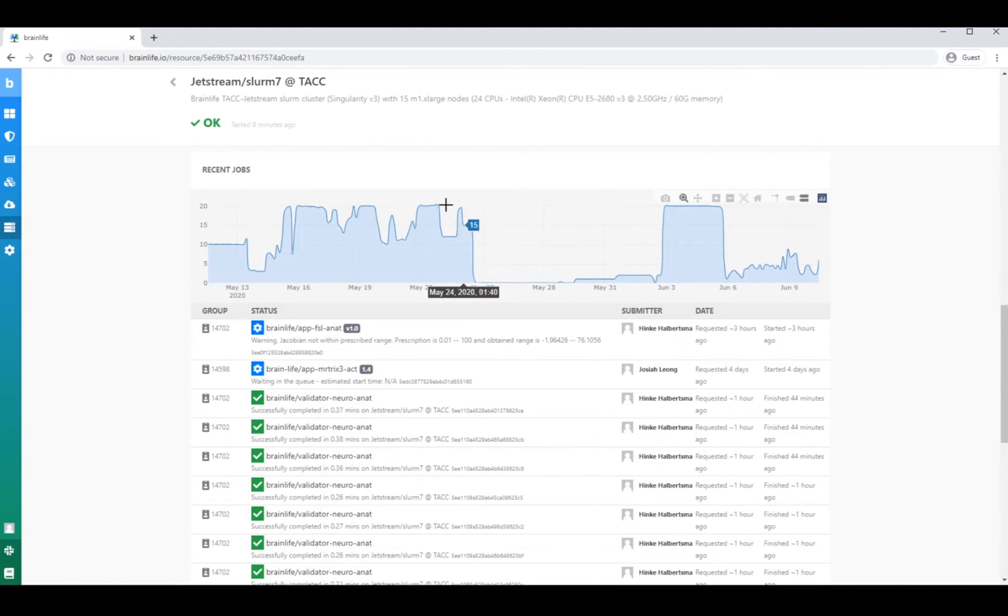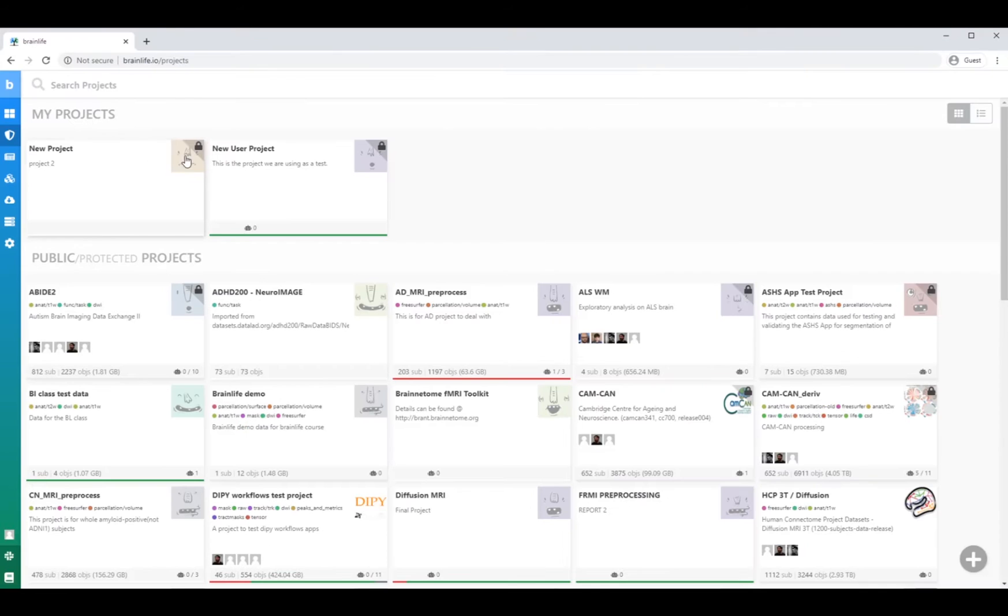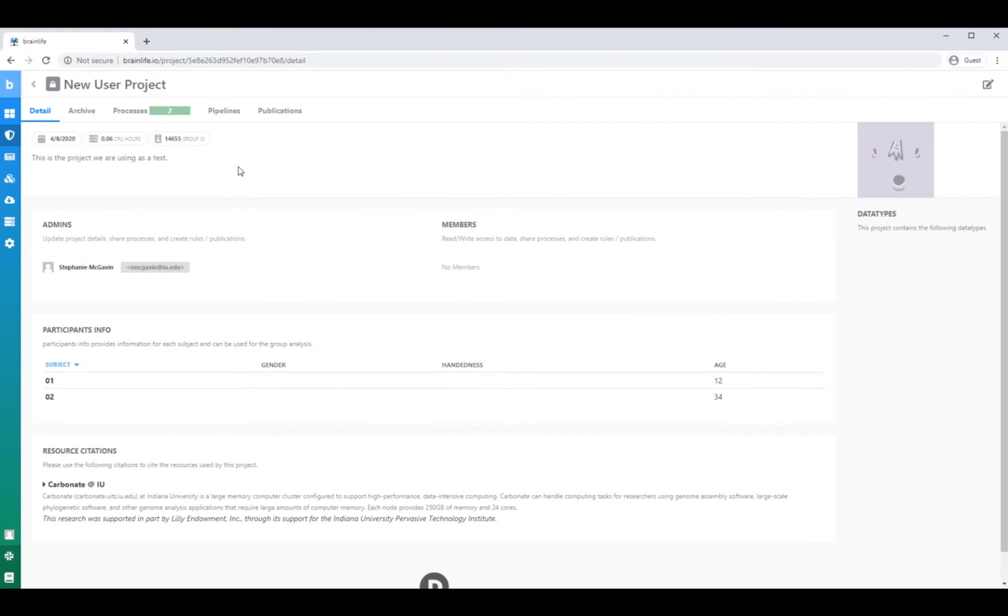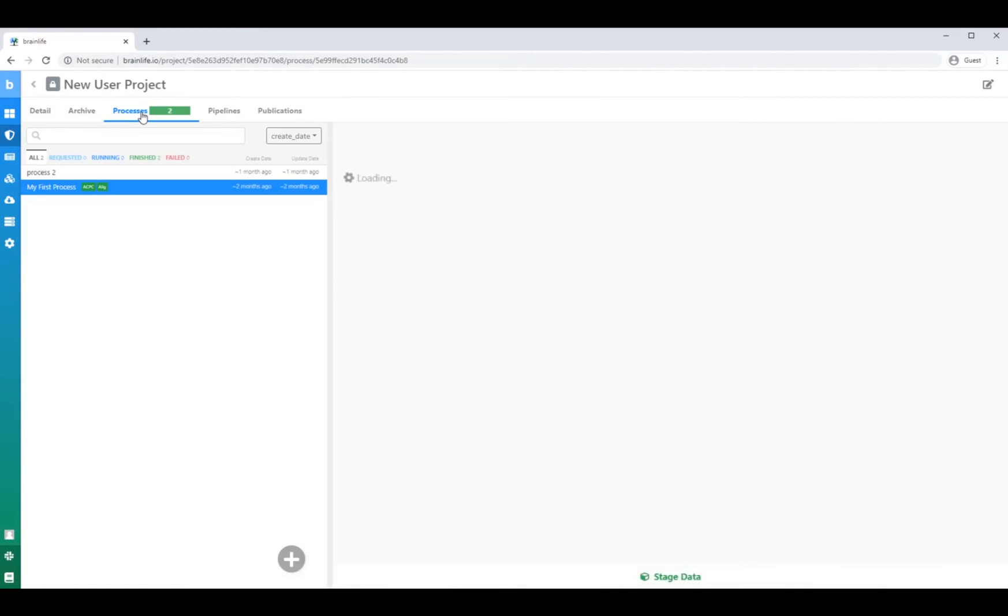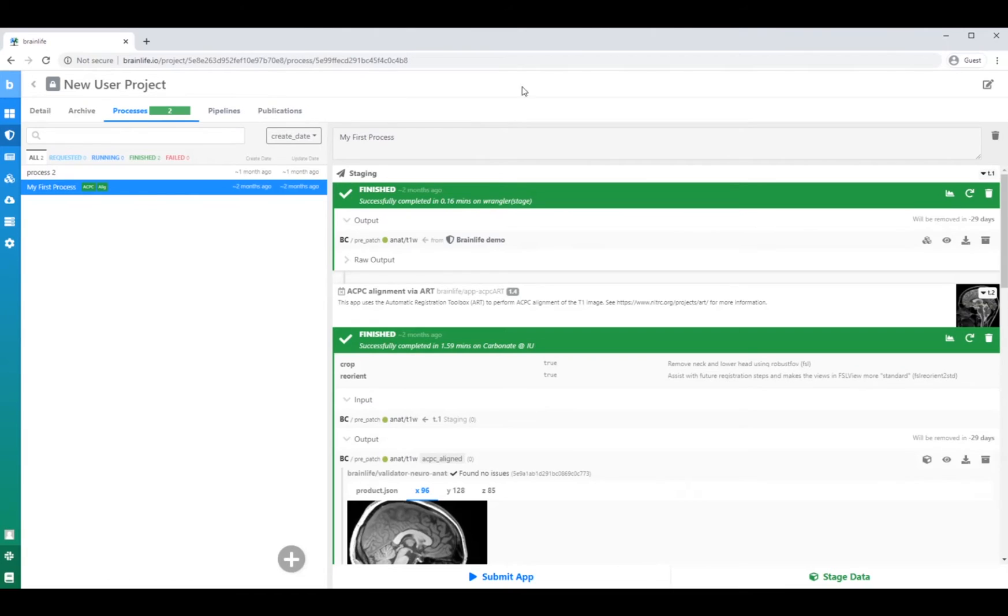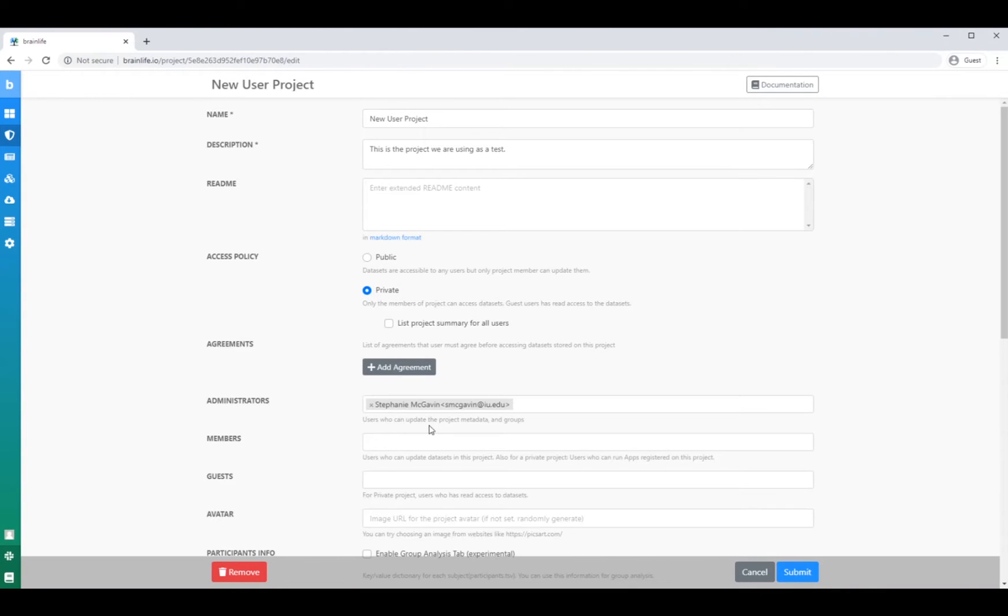Pretty cool, right? Now, let's dive just a bit deeper into BrainLife. In the projects page, you can organize your data sets, perform data processing, and share your research with project members.